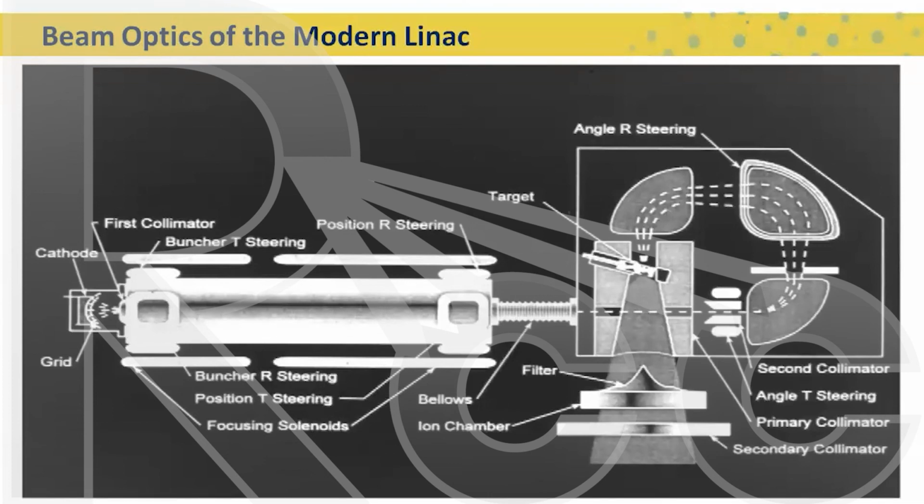The TrueBeam is set up with imaging built into it. The TrueBeam comes with a table that moves in 6 different directions. Not only up, down, in, out, left, right, but it has all of the rotational axes built into it. So it's called a 6 degrees of freedom table or a hexapod table. And you use that when you image the patient with the onboard CT scan on a TrueBeam, you target the tumor, you tell the table to put the patient in that position. The table moves the patient to that position. You turn on the beam, treatment lasts seconds, and you're done. And it's all conformal because it's all intensity modulated. So yeah, TrueBeam is the top of the line of the standard Varian linacs.